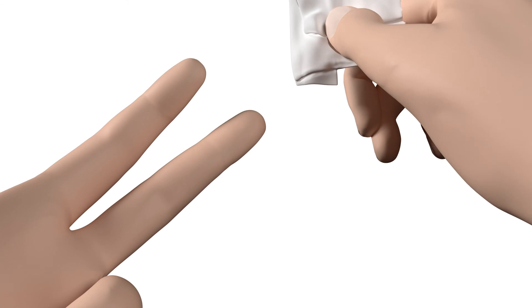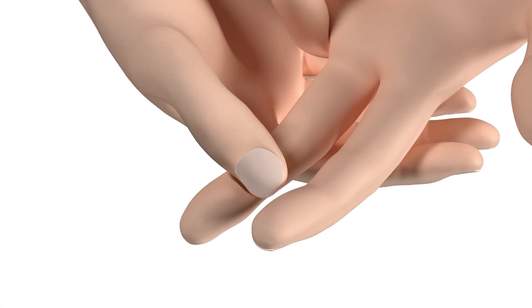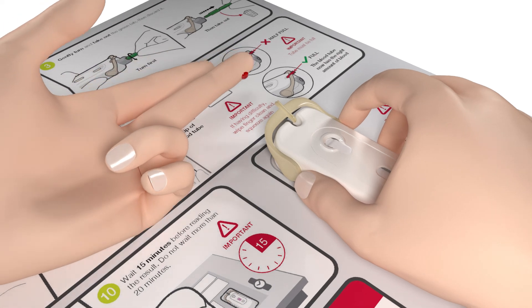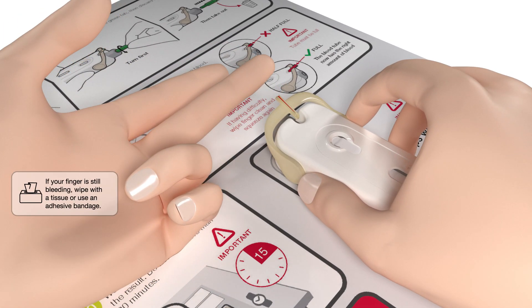If you don't get enough blood, wipe your finger and squeeze again until you get enough blood to fill the tube. Don't pick up the test as it should stay on the table. Hold your finger in a downward position and gently touch the blood to the tip of the tube so that the tube fills with blood. It is important that the tube is full; if necessary, repeat until it is full.